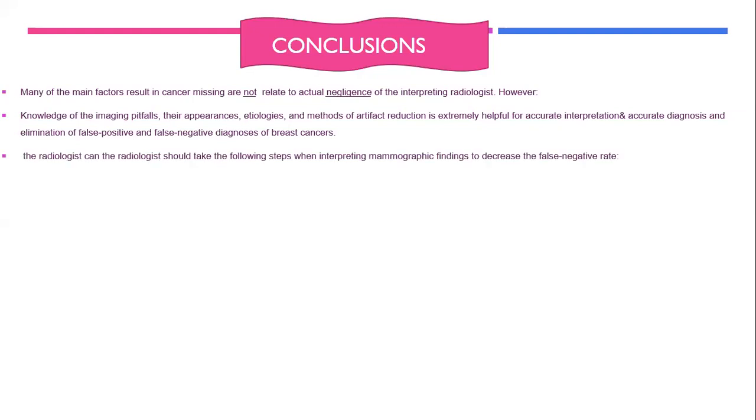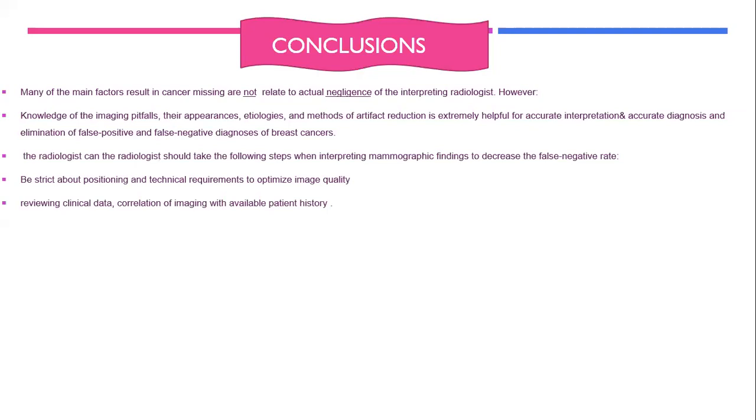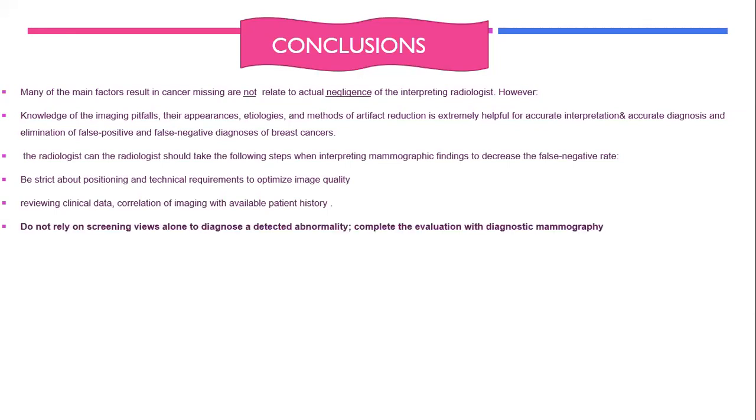The radiologist should take the following steps when interpreting mammography to decrease the false negative. They have to be strict about positioning and technical requirements to optimize image quality, reviewing clinical data, and correlating imaging with available patient clinical history.